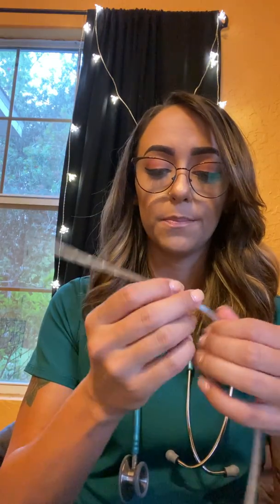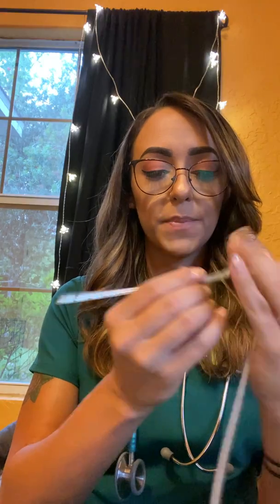So we're going to go ahead and bend at about 4 to 6 inches and just kind of make a little bend for the passageway into the nose, make it a little easier. And then we'll go ahead and lubricate the first 4 to 6 inches to get it started as well, or 3 to 4 inches. So you're going to tell the patient to extend their neck all the way up and back with a pillow behind their head.